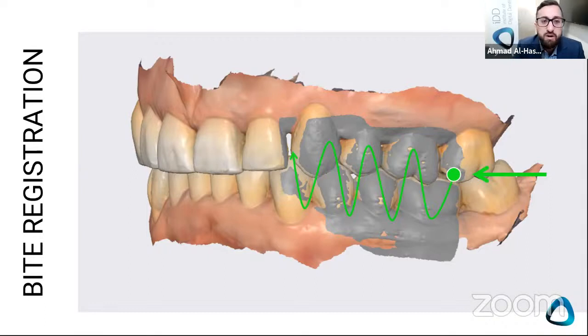Otherwise, to be honest, guys, a lot of this is really straightforward. I mean, when we started scanning, the scanners were single image scanners. Each time you clicked the pedal, it took one image, and you had to do this 50 or 60 times to take a scan. These days, they're so automatic. The AI is crazy. It's just knowing how to position, and it does most of the work for you.